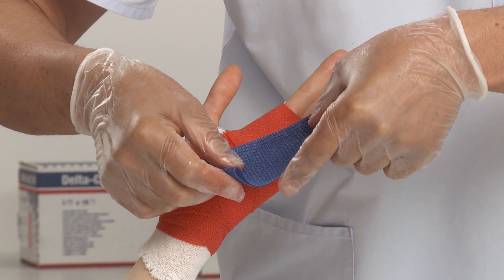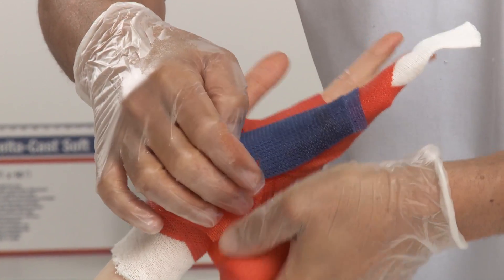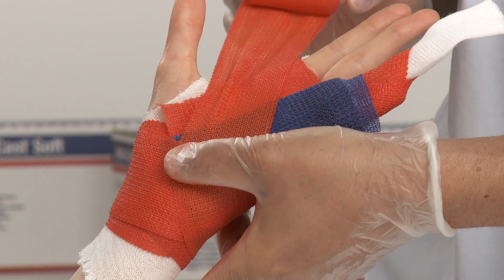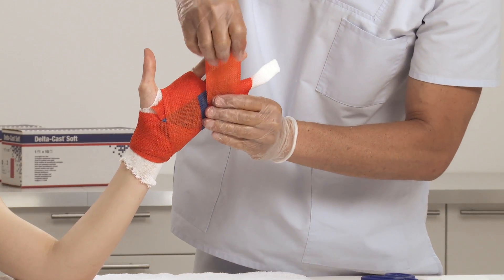Place the activated reinforcing strip on the palmar side against the fingers. Lock it down with cast tape starting at the wrist and going distally. Move towards the proximal end of the ring and small finger, making a cut to pass between the middle and ring finger.